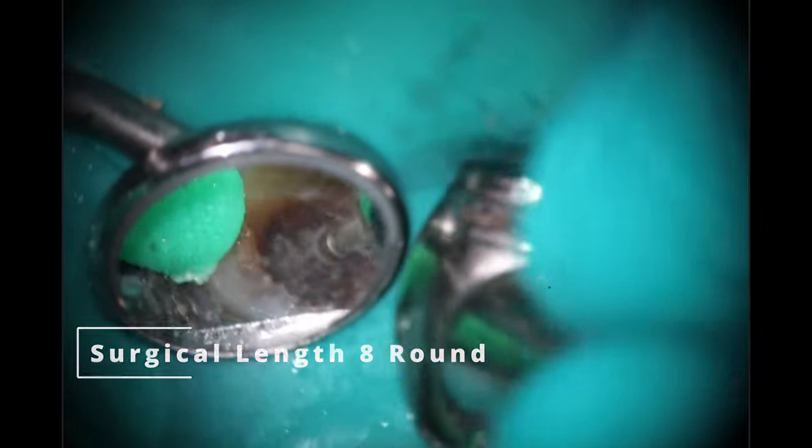So it's a length 8 round. Caries was a little bit larger than I anticipated — it went over into the distal. I was trying to keep that contact intact if possible; it makes for a much easier restoration and root canal in general. But as we were starting to get down inside there, you can see the caries, it's really soft, very velvety, and so it just scoops up really quite extensively. Expose the pulp at this point, but I'm mostly focusing on using that round bur for the caries. I don't like using round burs to access teeth — it gouges the floor quite extensively. So I'm using the 8 because that's what gets me the best tactile sensation for removing any decay.